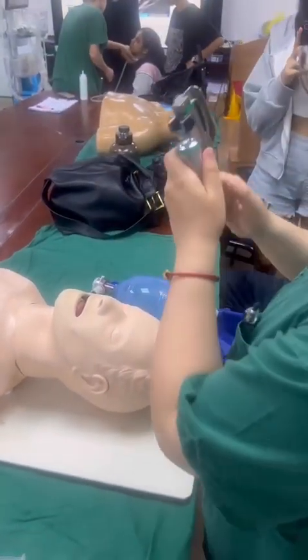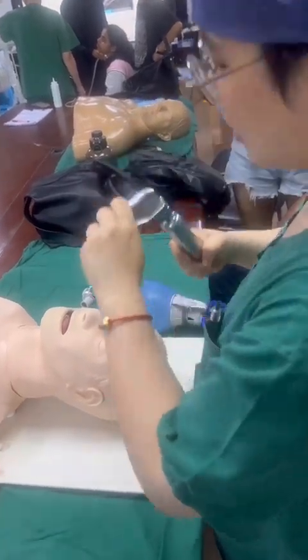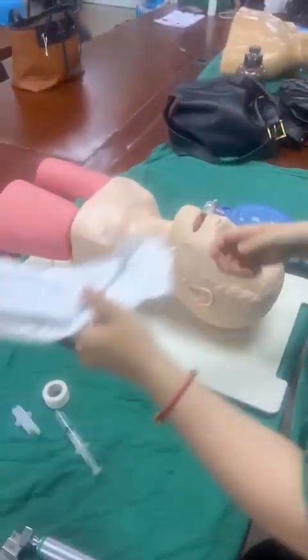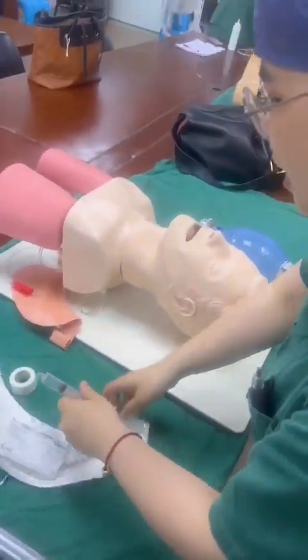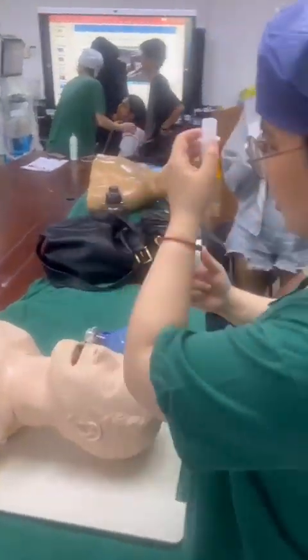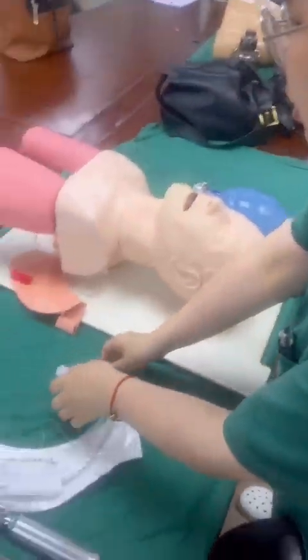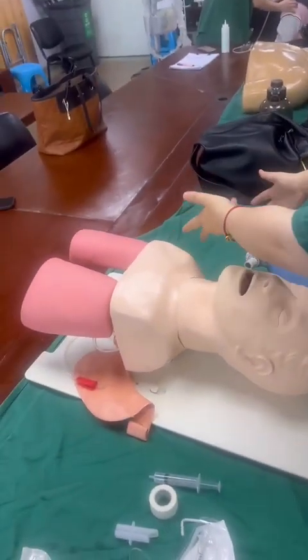Firstly, we need to read the laryngoscope and check its lighting. The second, we need a tube with the stylet. Then we need the syringes, teeth cushion, and the cap. Also, we need to check the suction is working around here.